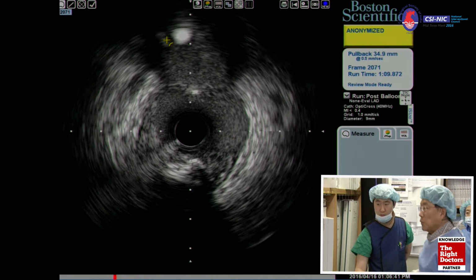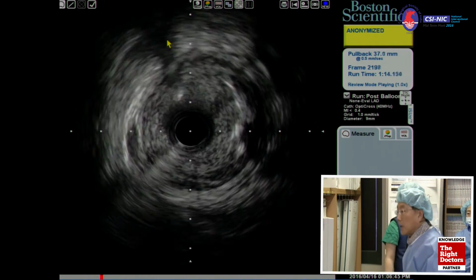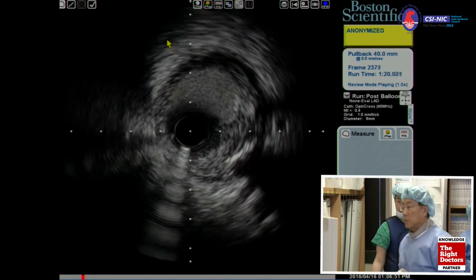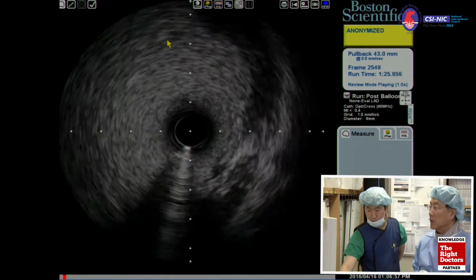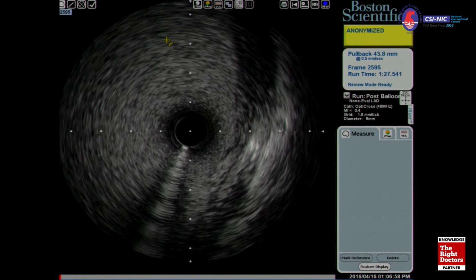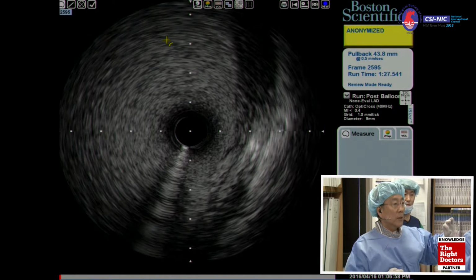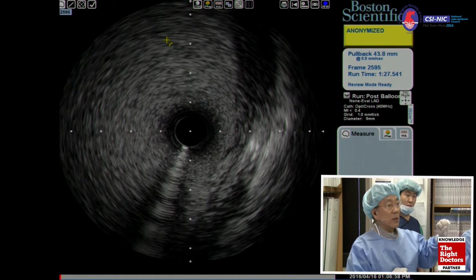They basically have diffuse disease. Okay, go on. All right, there is the main here. Larger plaque, very much. That is balloon damage here. I just see some ruptures here at 6 o'clock. So the issue is actually very diffuse disease, some significant disease from the LAD to the main, no doubt about that, right? If you look at the angle relations between the LAD and circumflex, there is some disease on the circumflex ostial part.